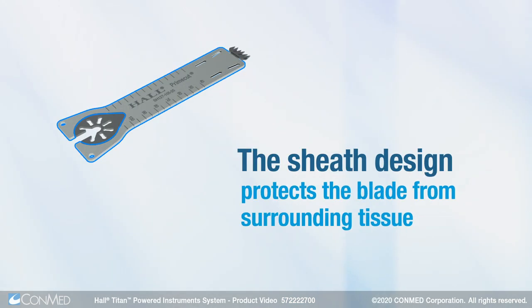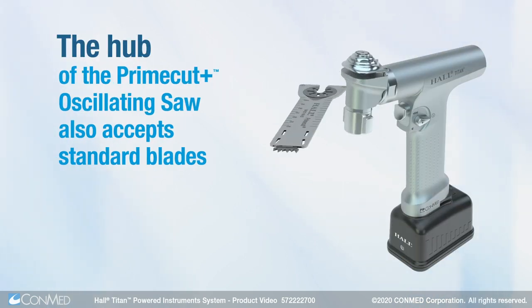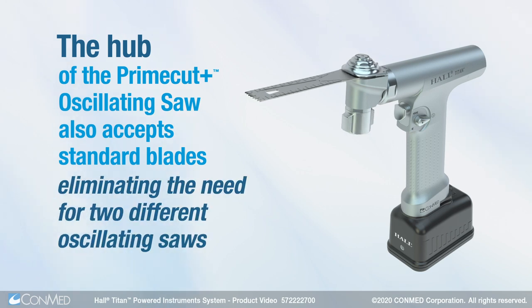The sheath design protects the blade from surrounding tissue. The hub of the PrimeCut Plus oscillating saw also accepts standard blades, eliminating the need for two different oscillating saws.